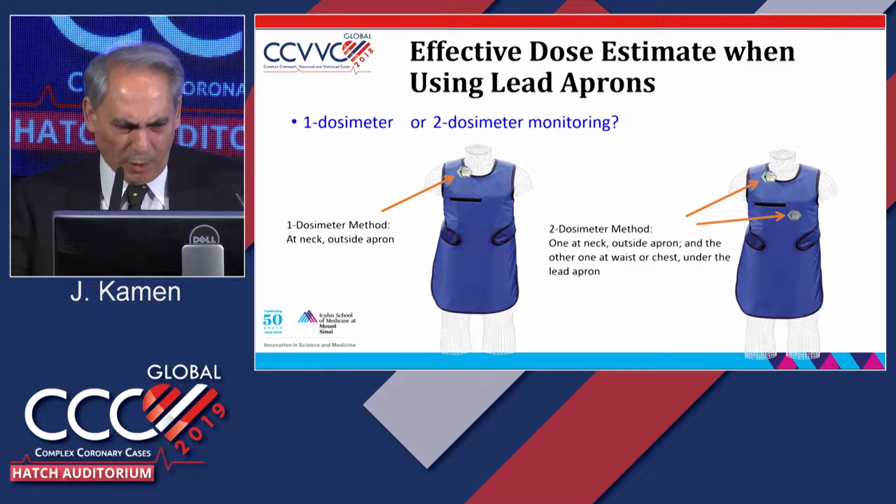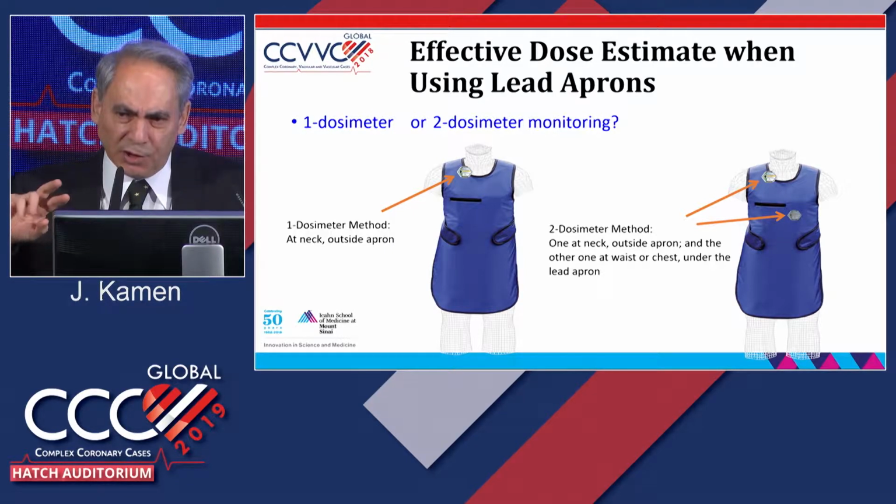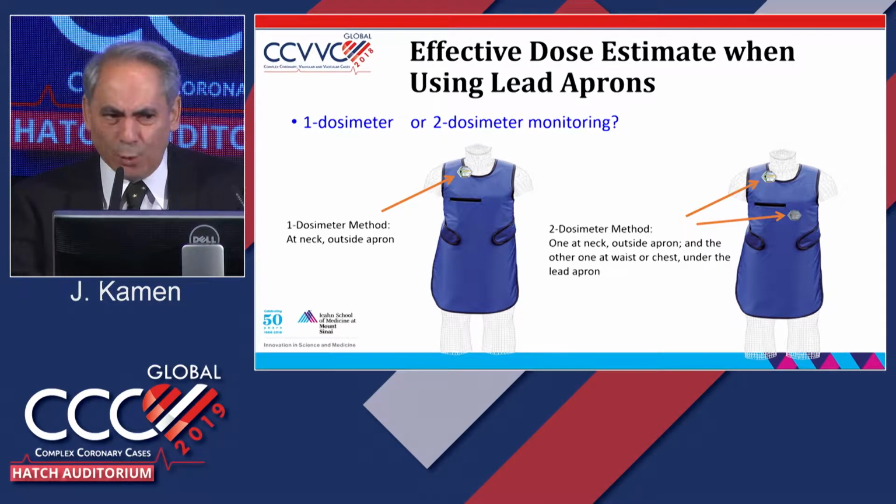We tried very hard and used this method in other institutions, and unfortunately, the physicians switch these two badges and the whole thing goes wrong. So we prefer one badge outside the apron, and we calculate how much would be under your apron from that badge.